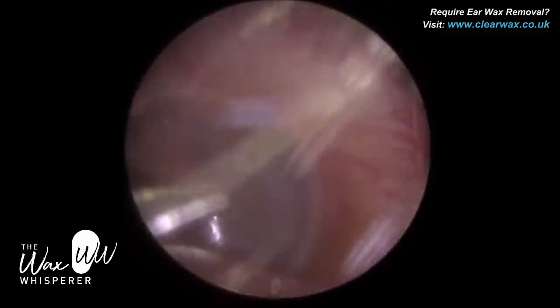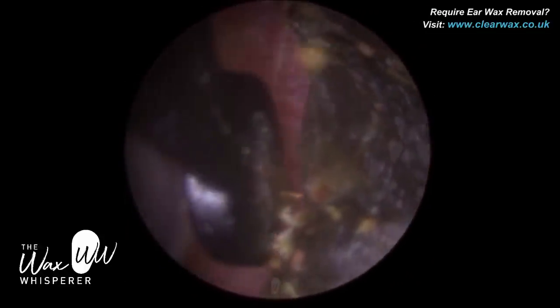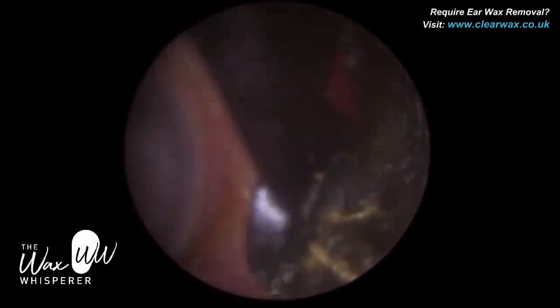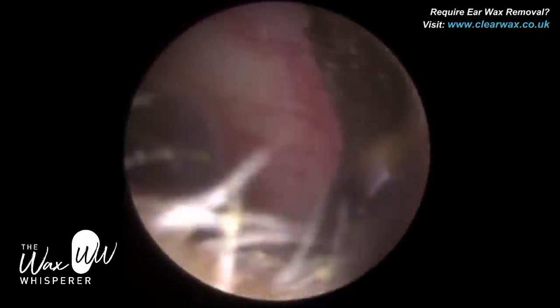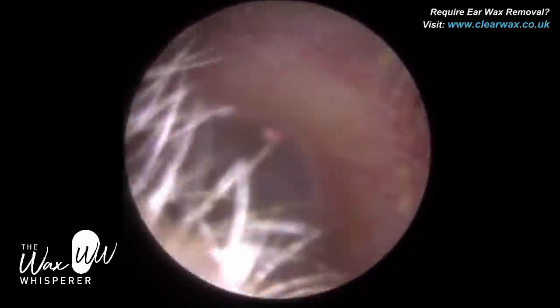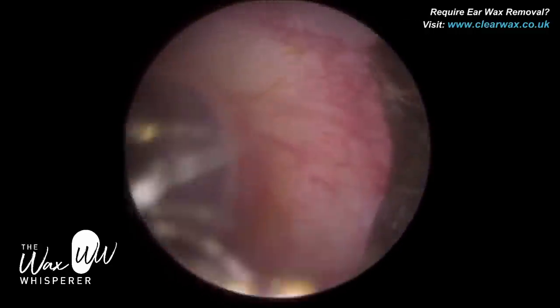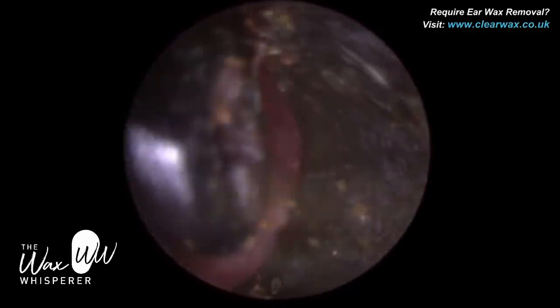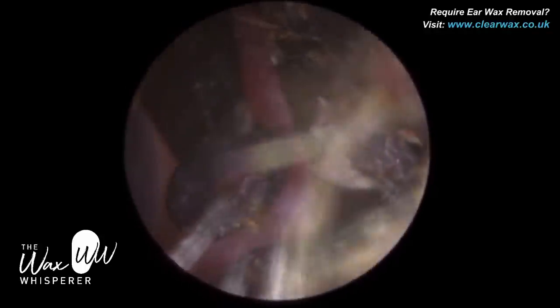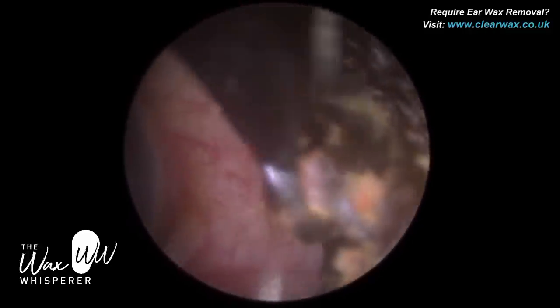So you're going to be very careful and cautious. Just with the jobson horn, getting good depth perception with the endoscope as well, just following that in nicely. Don't be working too far away because you lose depth perception. You can see it's stuck to the base of the ear canal, but you just keep slowly but surely maneuvering it away and off. This type of wax can almost be like butter or Nutella — chocolate spread — and you can inadvertently just spread it across the base of the ear canal because of that fudge-like consistency.